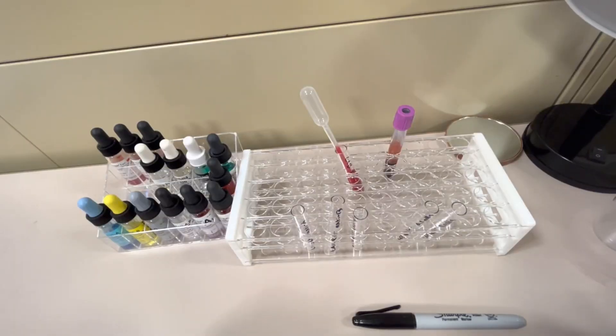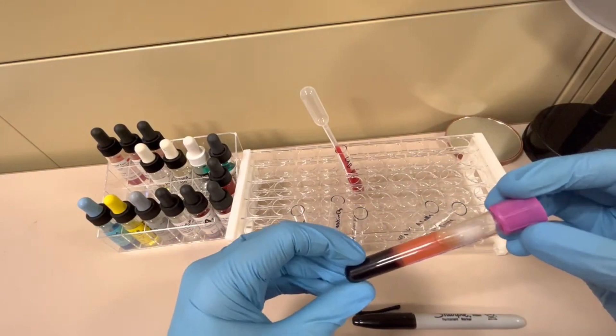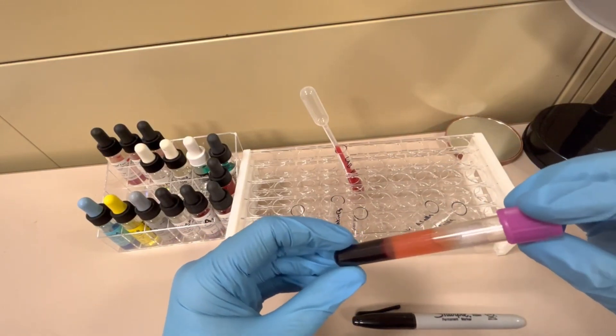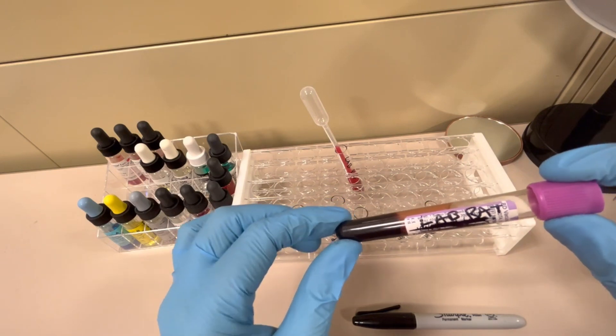Okay, so today I'm going to be demoing an ABO blood type, doing both the forward or front type and also the reverse or the back type. To do this, I need a couple of different things. The first thing is a properly labeled patient specimen. This is from a phlebotomy student of mine, and we've labeled the sample LabRat. How convenient.